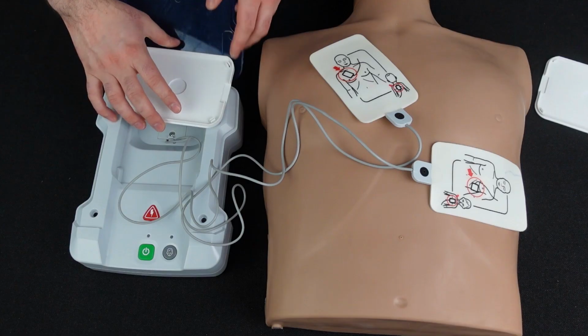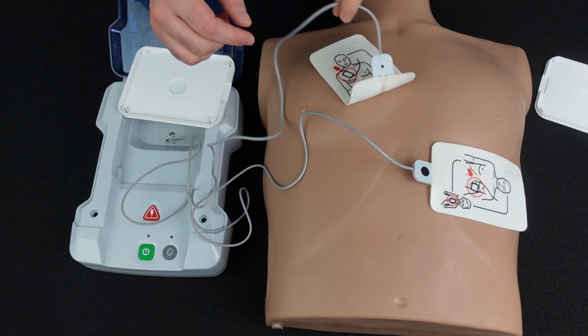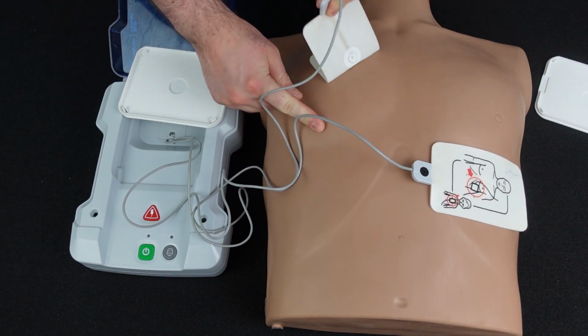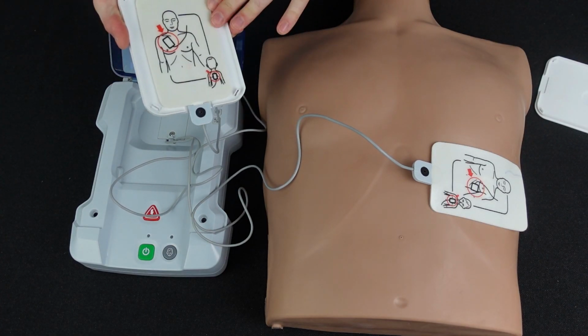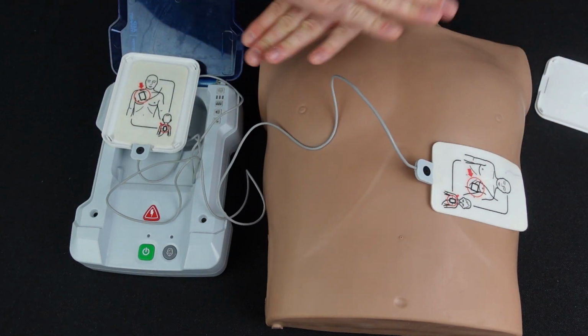When a training session is over, the pads will need to be removed from the mannequin and placed back into their storage case. When removing pads from the mannequin, remove the pads from where it is connected to the cable, not from the cable itself. This will prevent the wires from separating or breaking inside of the cable, ultimately elongating their lifespan.